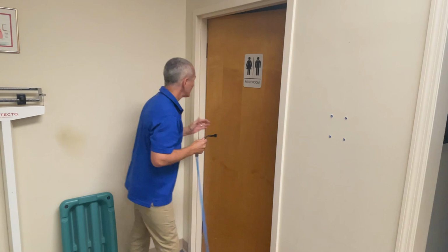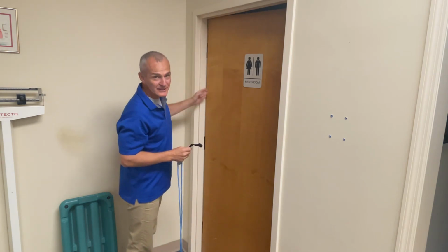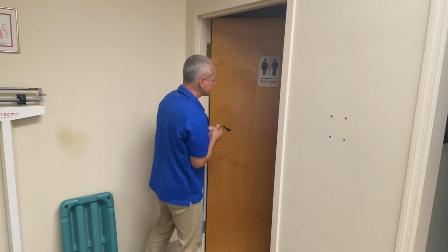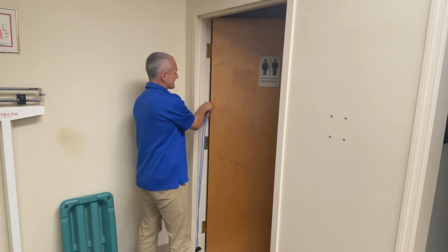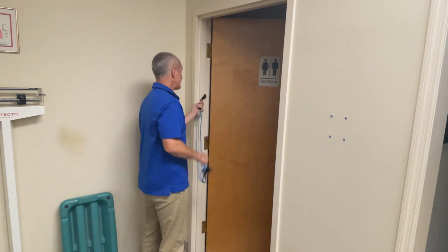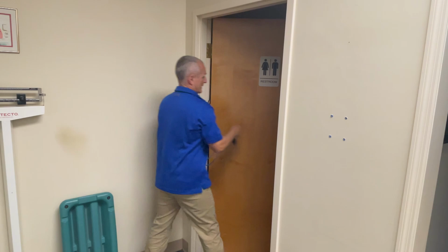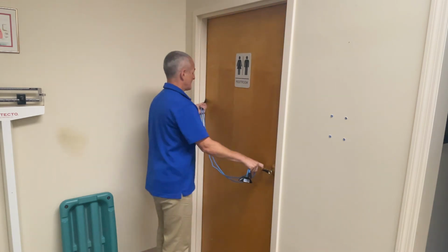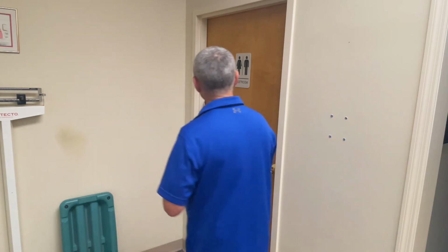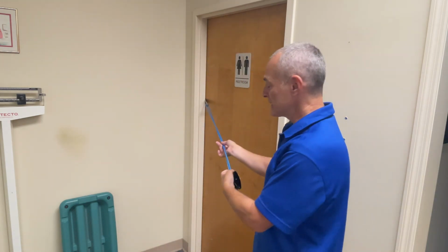So for example, here are the door hinges. What I'm going to do is I'm going to open either the closet or a bathroom door. I'm going to place the fat end of the fastener inside the door frame. And then I'm going to pull the door closed. And now what's happened is we've got more of a horizontal pulley system.